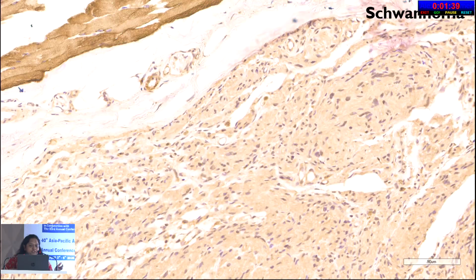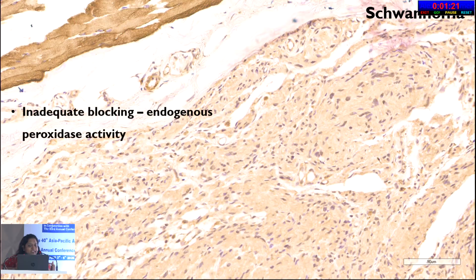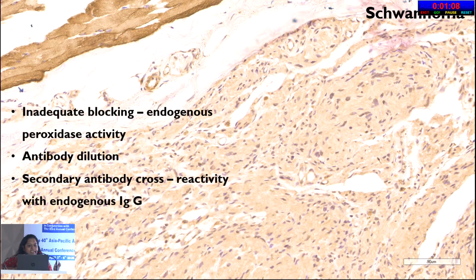So this was a case of schwannoma, and the antibody ordered here was desmin. Desmin should not be showing up in a schwannoma. But what is happening here? You can see that there was a control present in the tissue, which is brilliantly positive. But the tumor has also stained with desmin. Why did this happen? There was an inadequate blocking technique where the endogenous peroxidase activity was more. The antibody dilution might have been wrong, or there might have been cross-reactivity with the endogenous antibodies, or the technician might not have washed it properly.